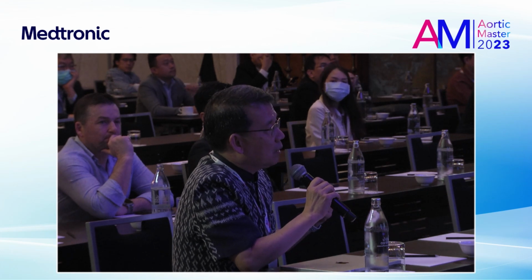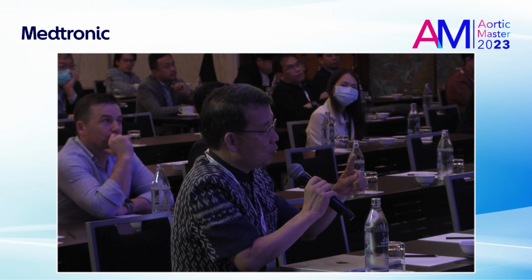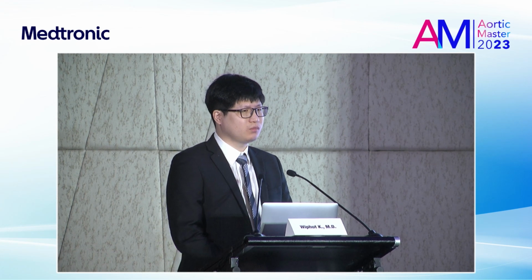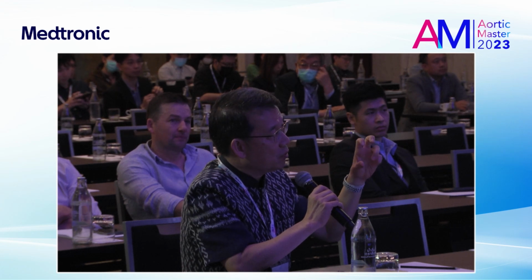Yes, please, Dr. Brun. Thank you very much, Dr. Wiphut, for a nice case. My question is, when we put the stent graft inside the surgical graft, it's a Dacron graft, right? Yes. We know that it can dilate over time, maybe up to 30% in the future. So how much oversizing will be more secure? Because you mentioned you have 24% oversize. I'm not sure that if the surgical graft dilates in the future, will that cause a problem? And the second thing is how much overlap do you suggest for this stent graft inside the surgical graft?